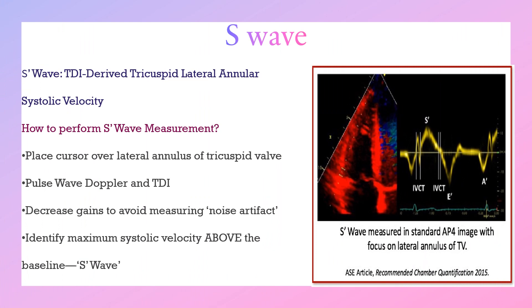Another method to assess RV systolic function is tissue Doppler S wave. Place the cursor over the lateral annulus of the tricuspid valve, then apply pulsed wave Doppler in tissue Doppler mode. Decrease the gain to avoid noise artifacts, and identify the maximum systolic velocity above the baseline, named the S wave. If the S wave is less than 9.5 cm per second, that indicates RV systolic dysfunction.